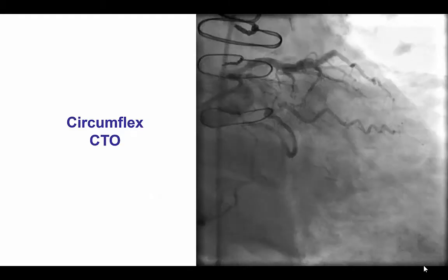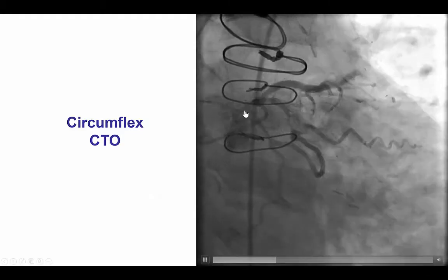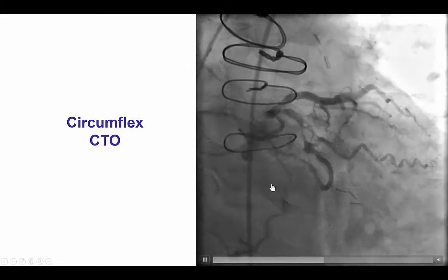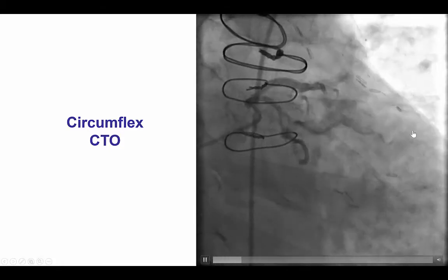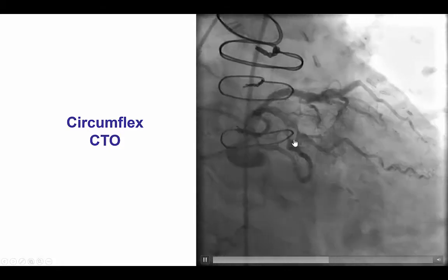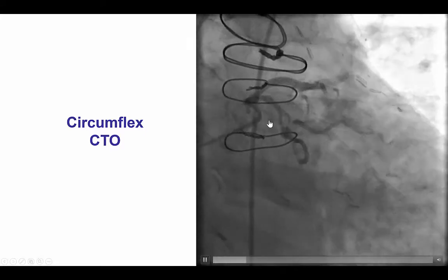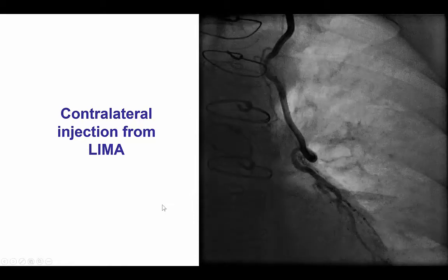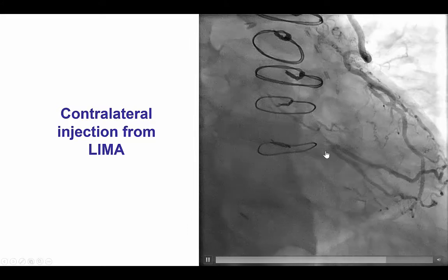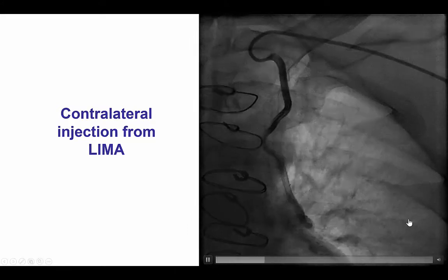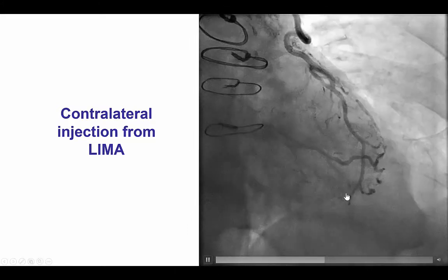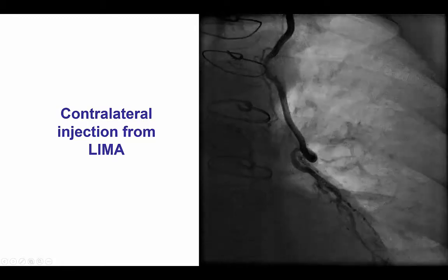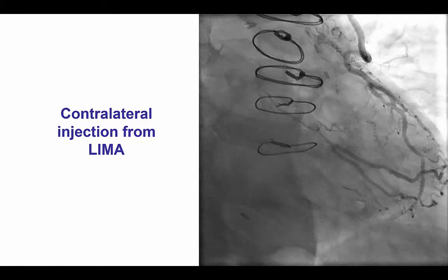This is the baseline angiogram. The patient has previous coronary bypass graft surgery and has a CTO in the mid-circumflex. However, it is unclear where the proximal CAP is because he has a first obtuse marginal branch and also has an atrial branch with unclear origin of the occlusion as well as the distal vessel. The distal circumflex and the large second obtuse marginal fill retrograde via epicardial collaterals from the LAD, which in turn fills from the internal mammary artery, making those collaterals challenging for retrograde crossing given that they were small and fairly tortuous.